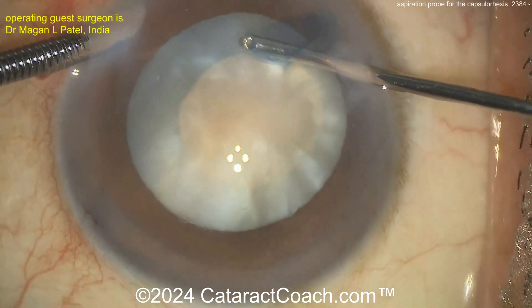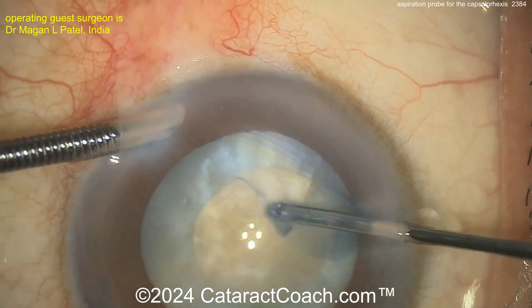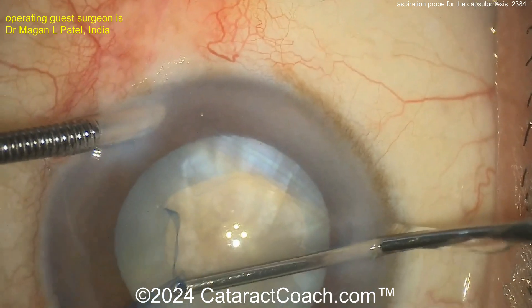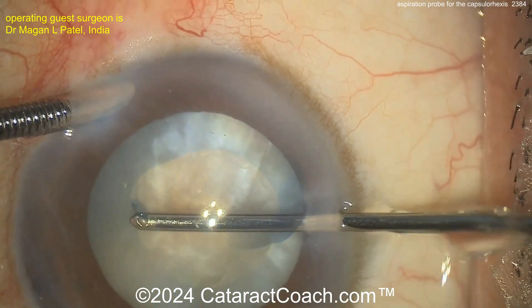You may have more control with the forceps. The surgeon is now enlarging it a little bit — can you enlarge it a little bit more than that? Beautiful. I was going to say it's a little too small of a rhexis, but a beautiful spiral-out technique here.